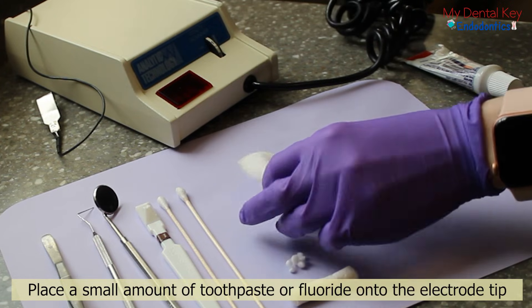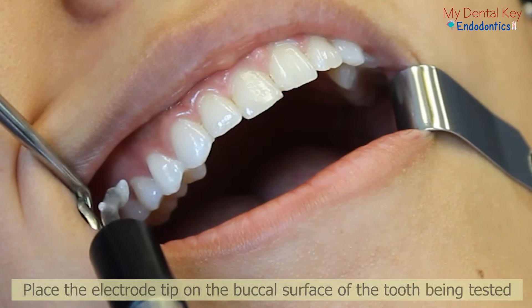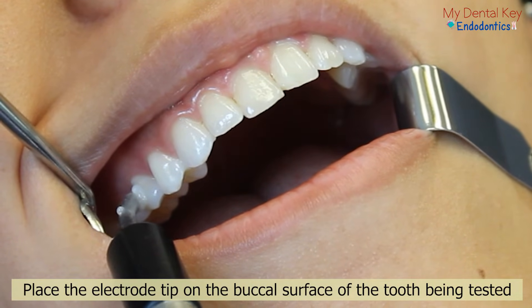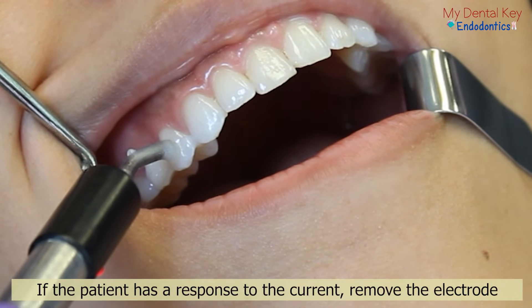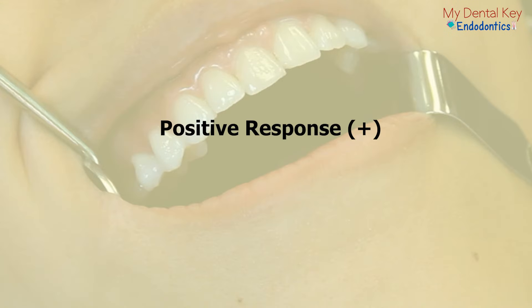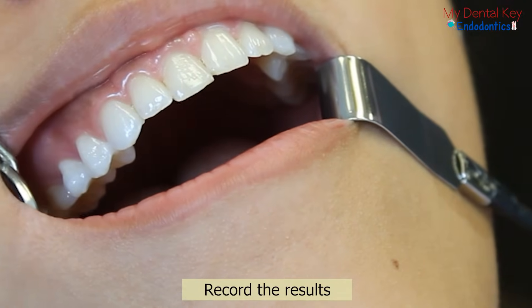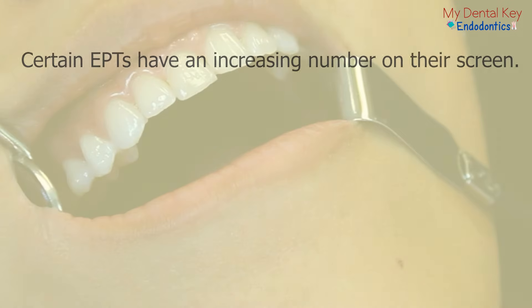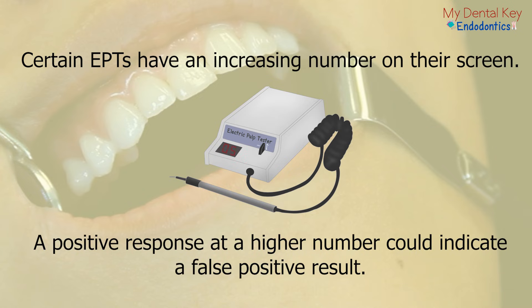Place a small amount of toothpaste or fluoride gel to act as a conductor onto the tip of the electrode. Then, place the tip of the electrode against the buccal or facial surface of the tooth you are testing. If your patient has a response to the electric current and raises their hand, remove the electrode immediately. This is a positive response and indicates that the pulp is responsive and most likely vital. Record the results in a record-keeping table. Notably, certain electric pulp tests have an increasing number on their screen — a positive response at a high number could indicate a false positive test, so it is important to compare the response to control teeth.